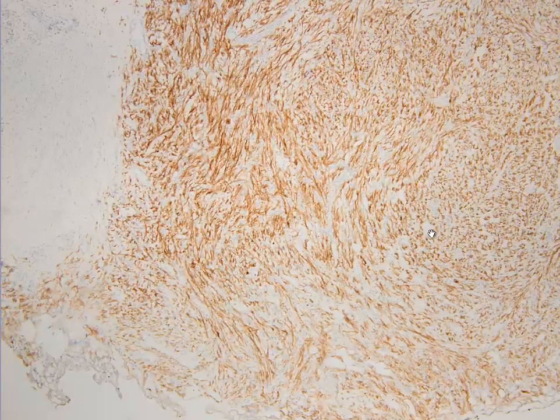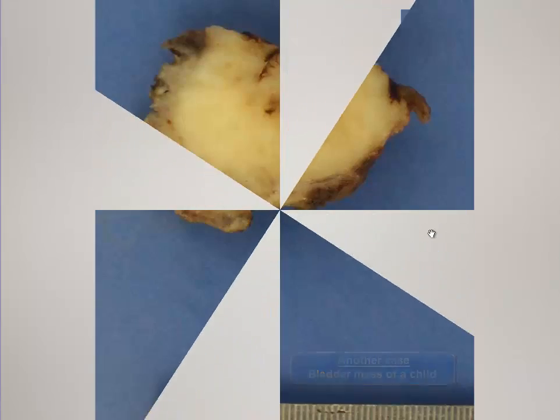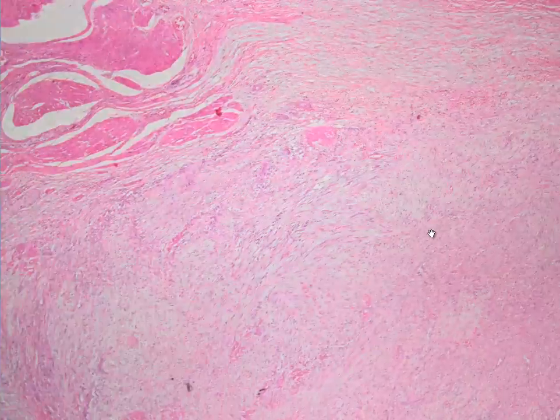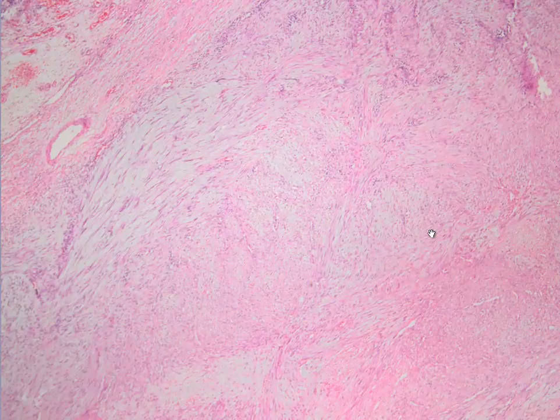inflammatory myofibroblastic tumor. So cytokeratin staining is a very important and common pitfall for the IMTs. IMTs stain with cytokeratins. And here's another case in a child, and again the bladder. As you see here, we have this pushing infiltrative pattern into the muscularis propria, and of course in childhood the embryonal rhabdomyosarcoma is much more prevalent and first comes to mind.